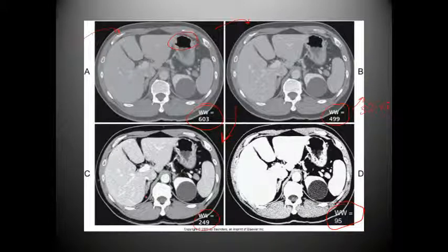However, if we go too far, we get tons of whiteness, and so we can see that we lose some of the definition here on the border of the liver. We'll see some of the vascular structures, but we don't see all.